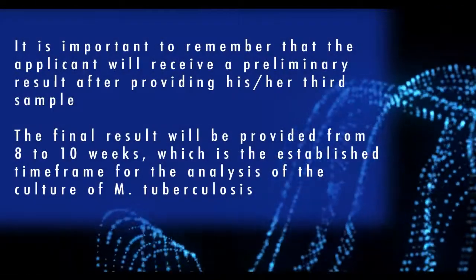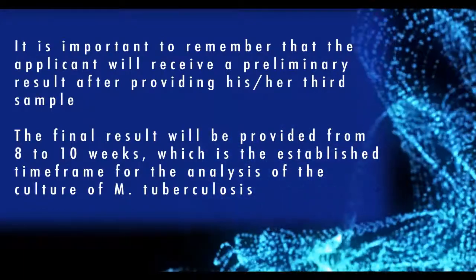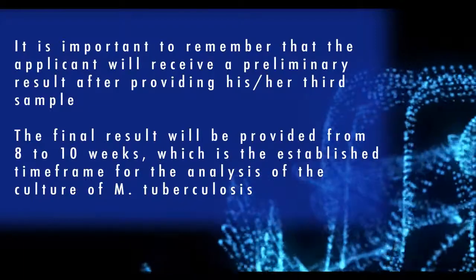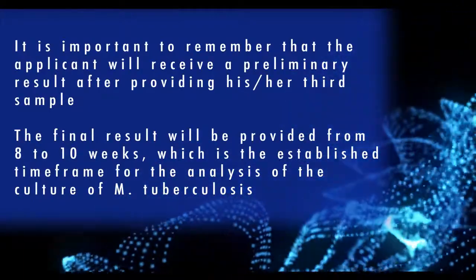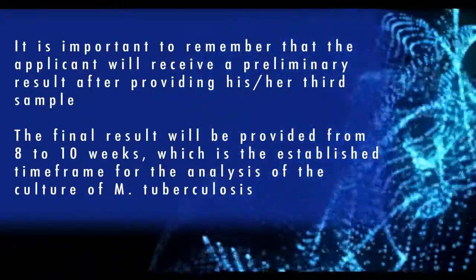It is important to remember that the applicant will receive a preliminary result after providing his or her third sample. The final result will be provided from 8 to 10 weeks, which is the established time frame for the analysis of the culture of M. tuberculosis.